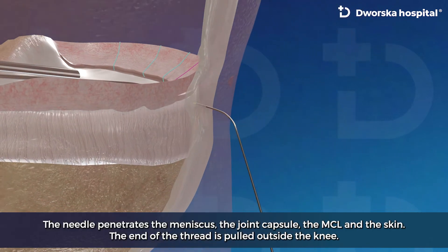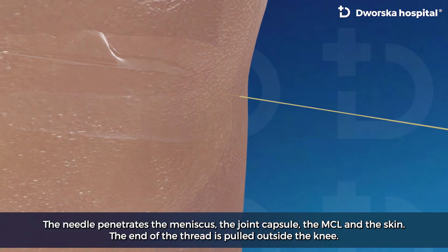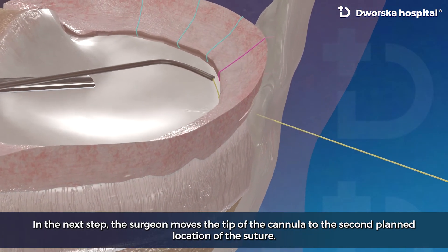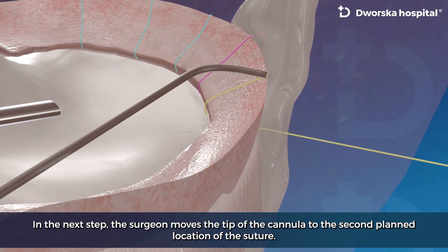The needle penetrates the joint capsule, the MCL and the skin. The end of the thread is pulled outside the knee. As the next step, the surgeon moves the tip of the cannula to the second planned location of the suture.